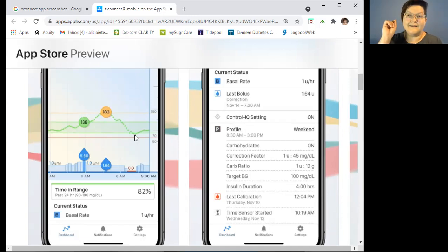Yes, I was going a little longer in an elevated state, but I was then going significantly longer at a lower state. And I'm not sitting at 200. I was still in range. My time in range didn't change. In fact, it actually went up probably a little bit because I didn't have any scraper lows. And at the same time, I was working my food bolus timing.